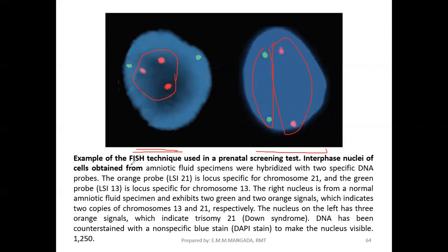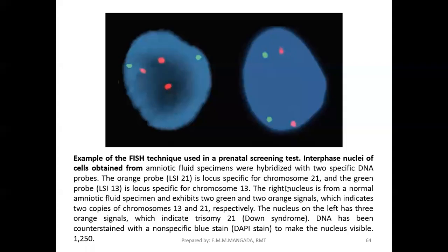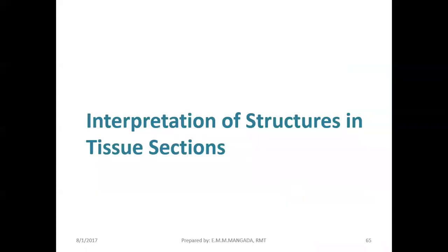Okay? So, that's the application of our in situ hybridization. So, na-detect natin. Okay? For microorganisms, yun yung example ko naman sa inyo, detection. For example, na-detect mo anong exactong microorganism yung causing infection, or more specifically, anong strain. Okay? So, that's your hybridization technique.